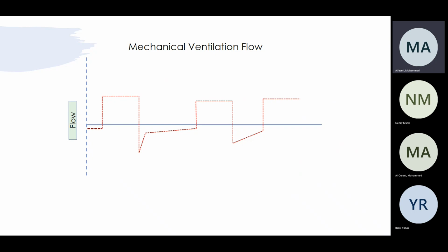The air went in during inspiration, flow went in, it filled your lung smoothly, is that right? And then now the valve opened, and your volume will go out, and the flow will go out. Usually it should just go out slowly, until you reach the baseline. But in this period of time, it went back up close to the baseline quickly, and then it slowly goes back.